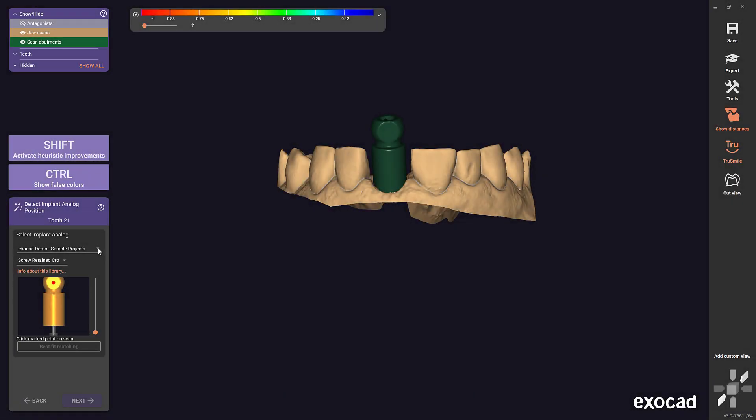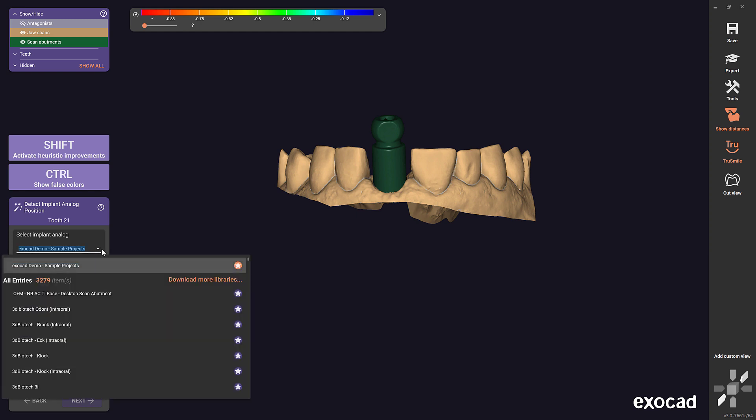Did you know in Galway release with the library manager function, library installation for dental CAD is easier than ever before? By clicking on download more libraries under select implant analog in the implants position wizard step, you can install or update libraries directly from within the ExoCAD software.